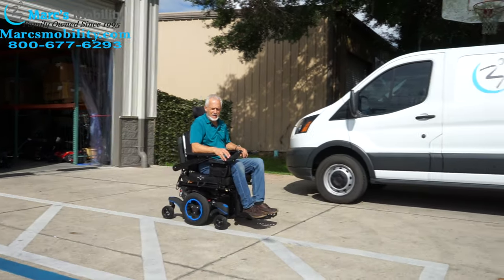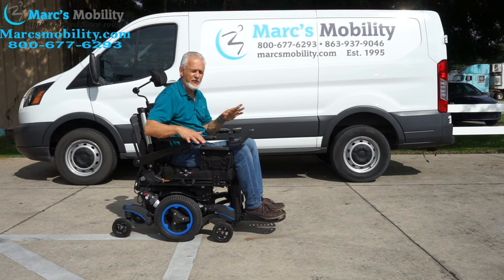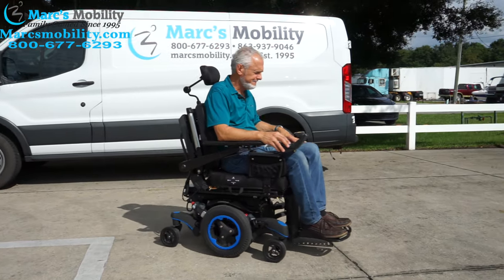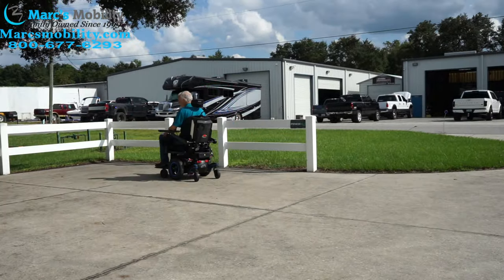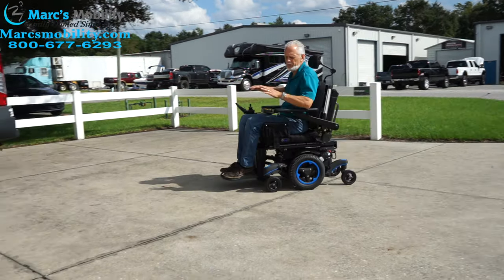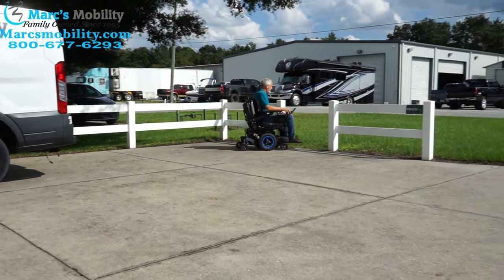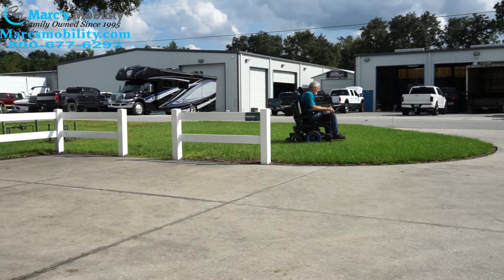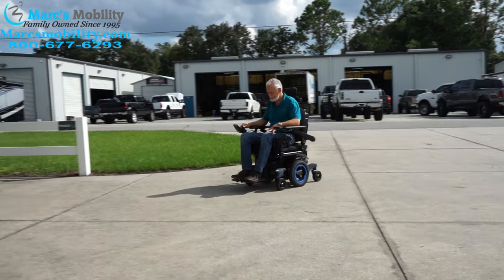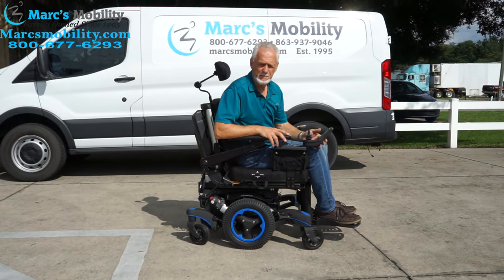Outside, the Quickie 700M is a really smooth, heavy power chair — you can feel it just in the way it rides. You can feel the suspension when turning right or left. The top speed on this chair is six miles an hour.